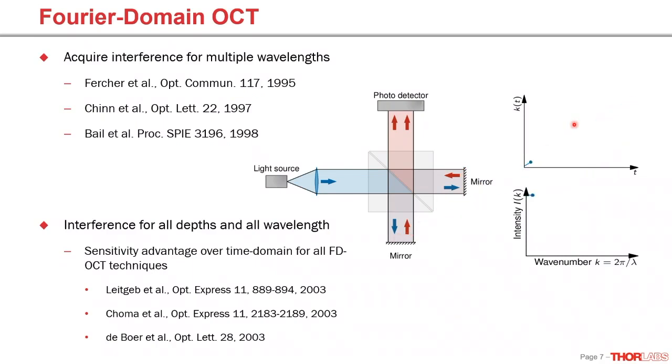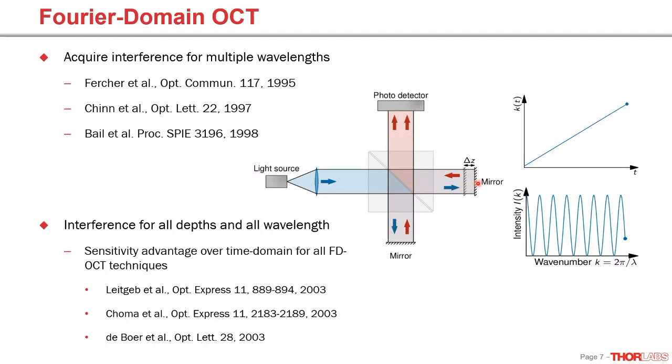And now you change the wave number of the light, and independent of what wave number or wavelength you put into this interferometer, you will always detect positive interference in this photodetector, assuming there's no phase jump at the beam splitter. But if you change the position of this mirror and put in some difference there, now it depends on the path length difference between the original position and the new position whether there's constructive or destructive interference, and it will also depend on the wavelength.